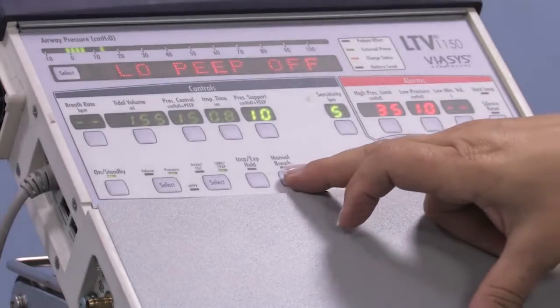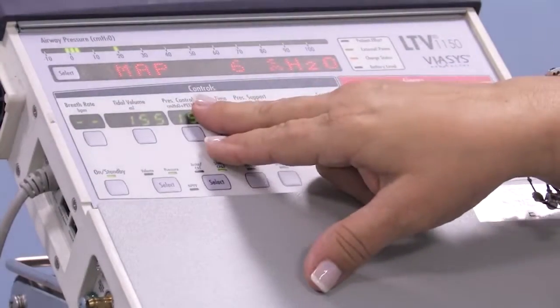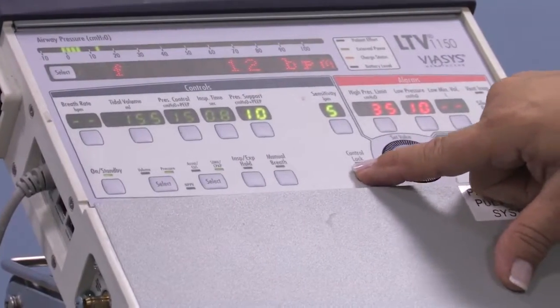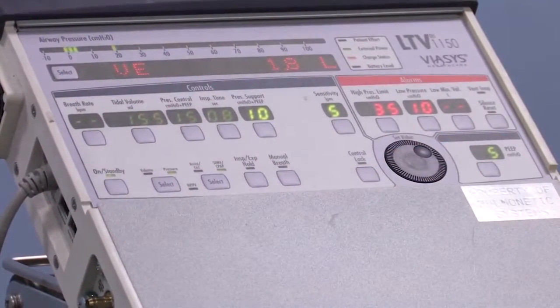And if you push the manual breath button, you get one breath of that type as well. So it's very important to have these set properly, even if you're just using straight pressure support. In addition, I think I mentioned earlier, there's a control lock button which you can turn on so that if someone tried to turn a button, it would say locked. That can be turned on and off.